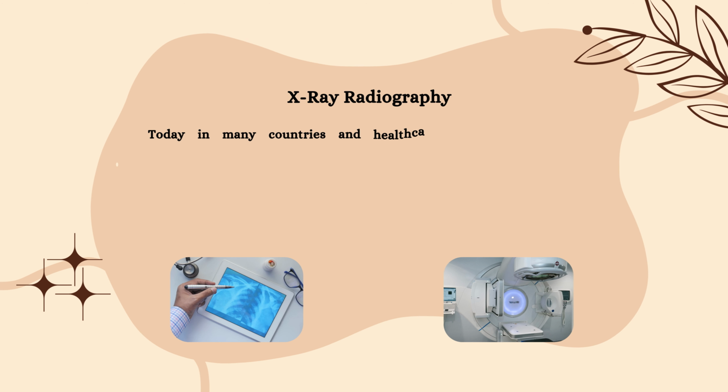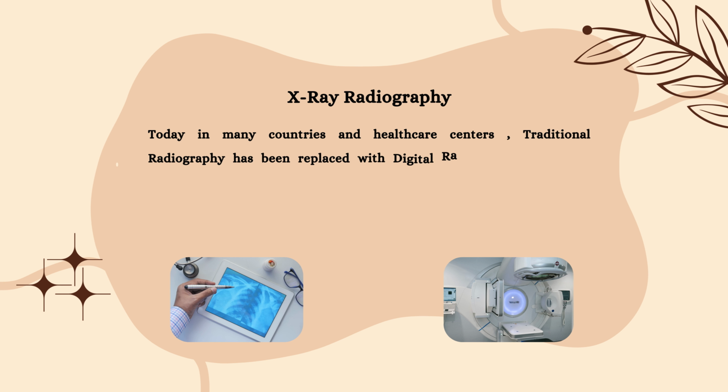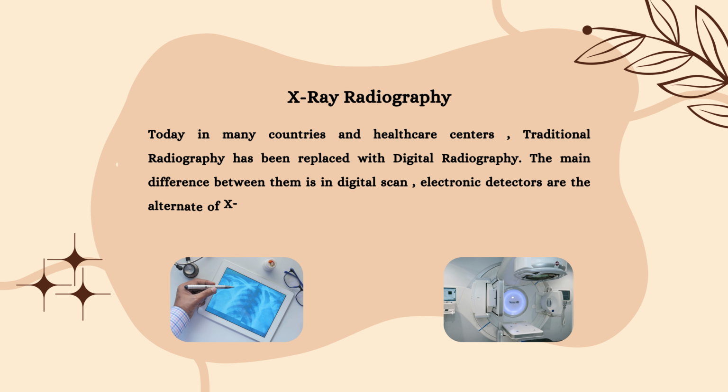Today in many countries and healthcare centers, traditional radiography has been replaced with digital radiography. The main difference between them is in the digital scan. Electronic detectors are the alternative to X-ray films. So the final product of radiography is a digital image file instead of large X-ray films.